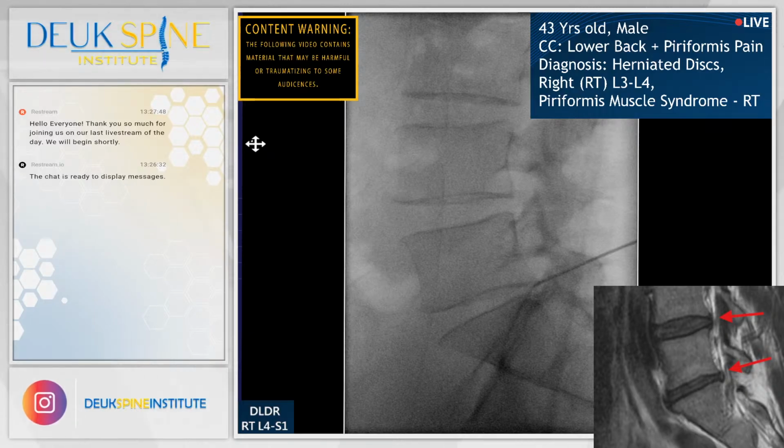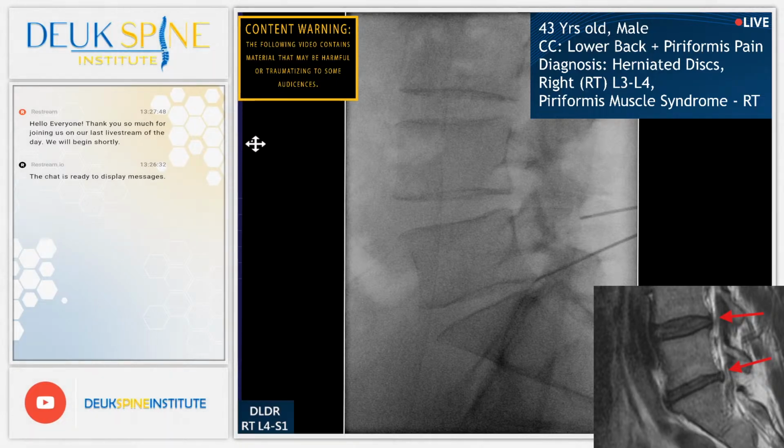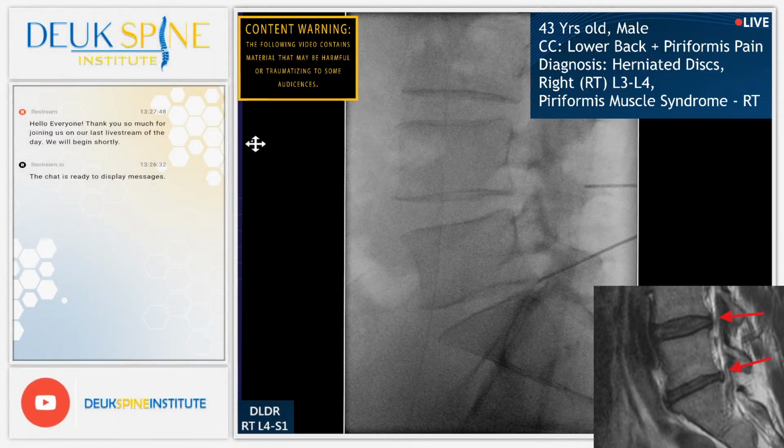Our incision is 7 millimeters. The surgery is almost bloodless. We have usually on average around one milliliter of blood loss the whole surgery, even when we're doing 2 or more discs. Any questions from our audience?